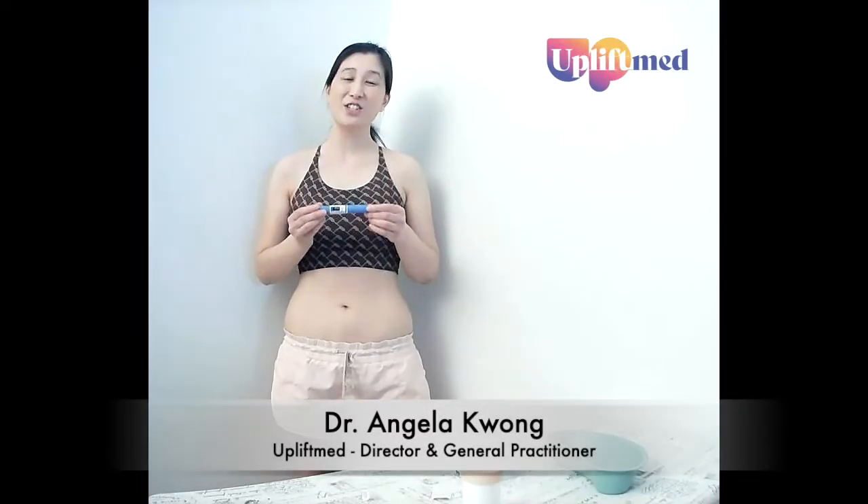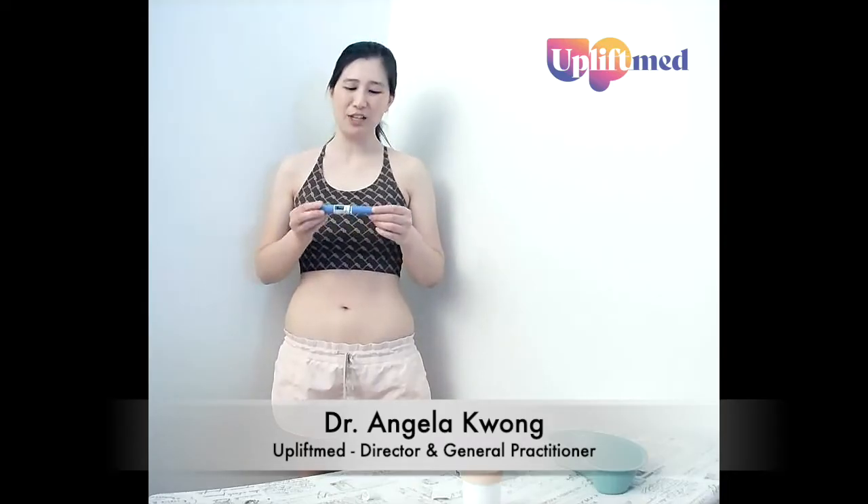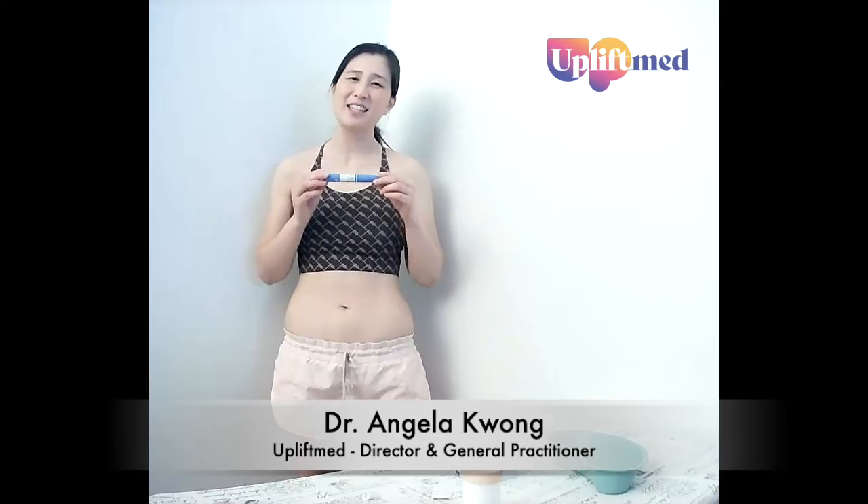Hi everyone, this is just a short video on how to give a subcutaneous injection. For today's demonstration video, I'm using a Semaglutide Ozempic pen, but it's the exact same process for a Liraglutide Saxenda pen.